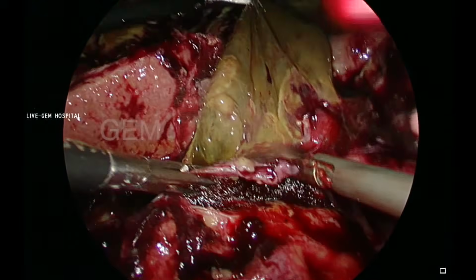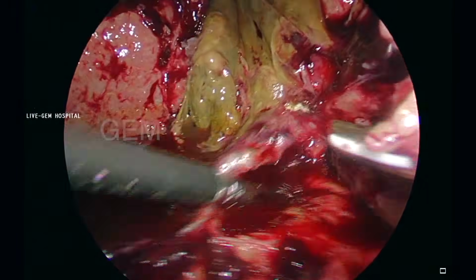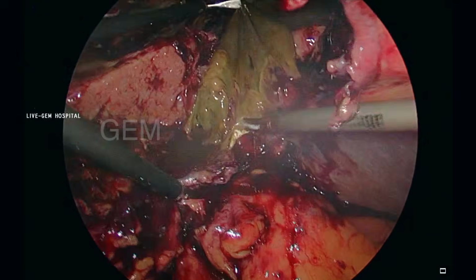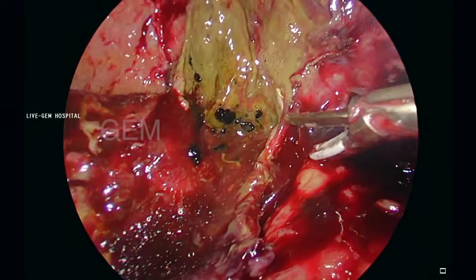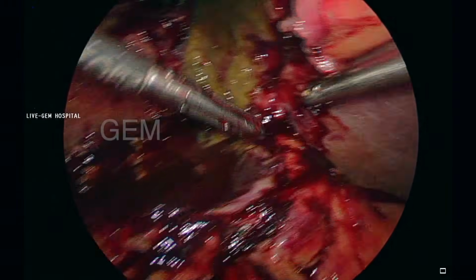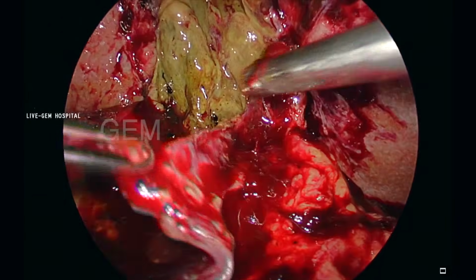So it is very dense. It is a very late presentation. It is not possible, so I am just using the ultracision. The entire gallbladder wall has become gangrenous. So to prevent perforation, the omentum will seal nicely, the omentum and the duodenum. So we have to be very careful not to injure the duodenal wall. And again I'm looking more medially.